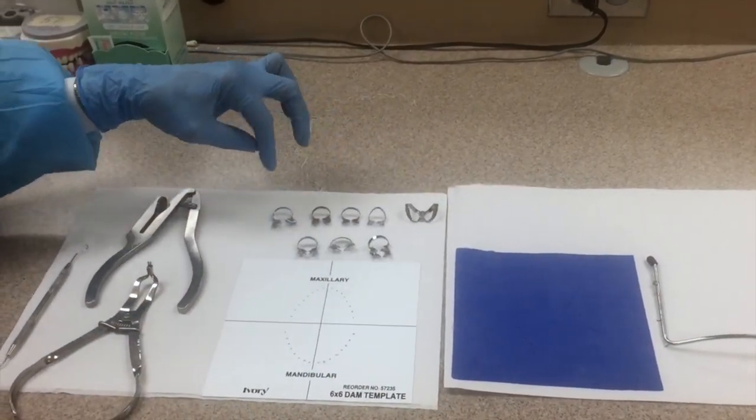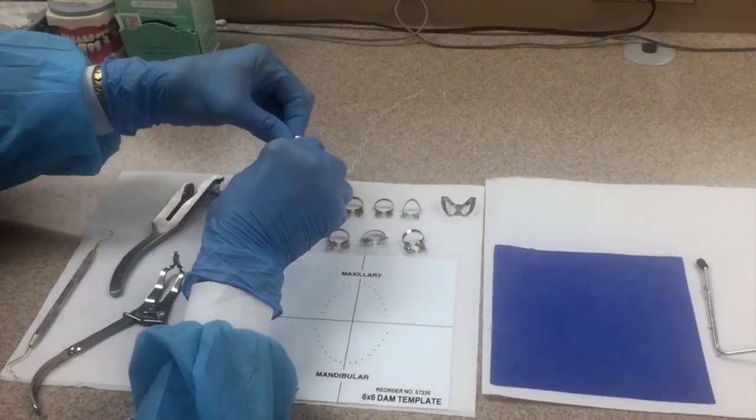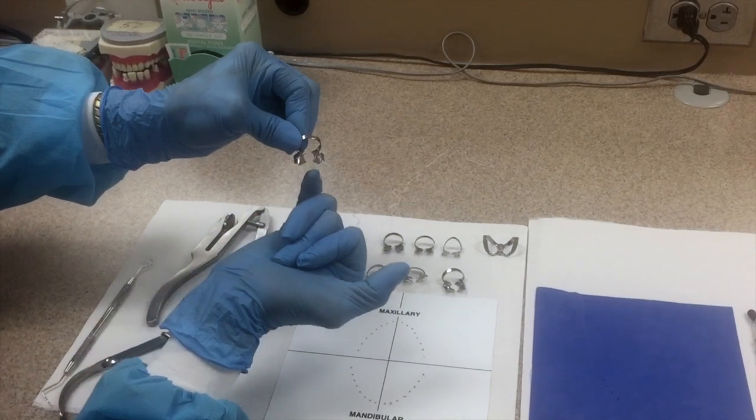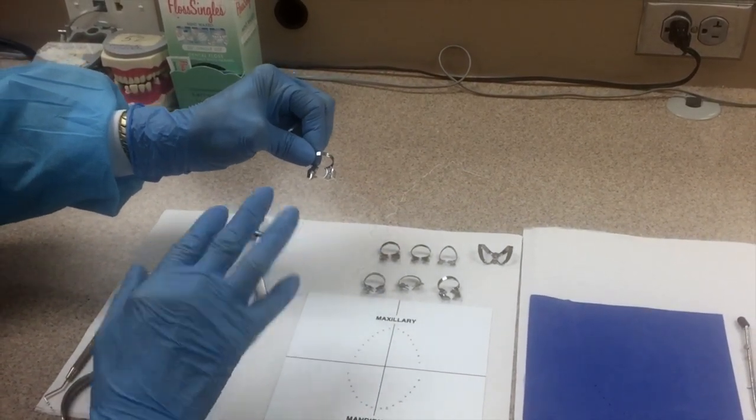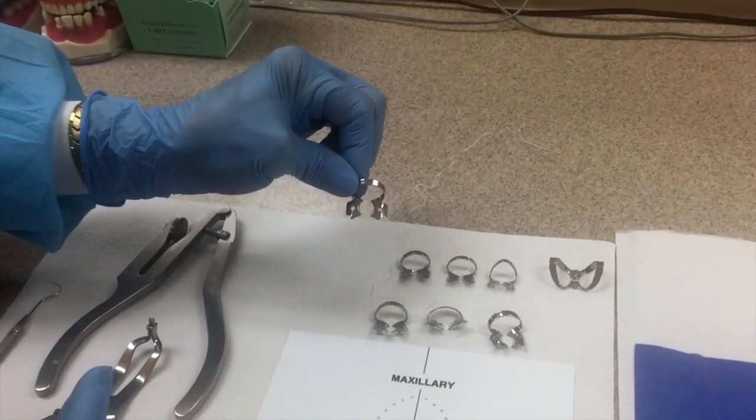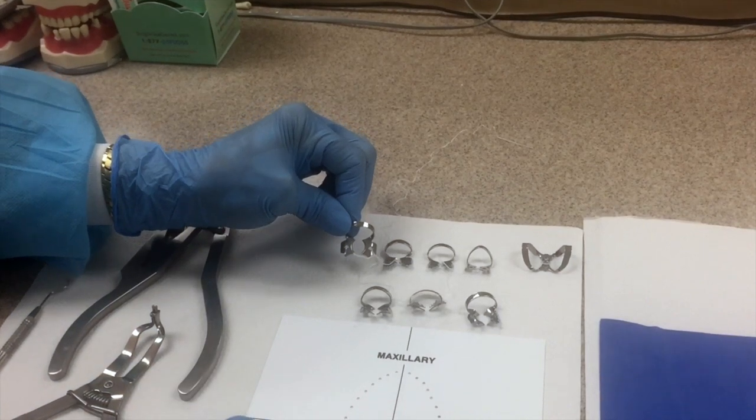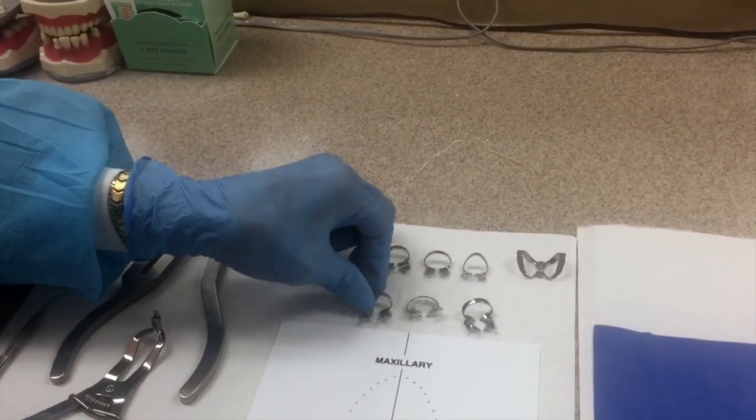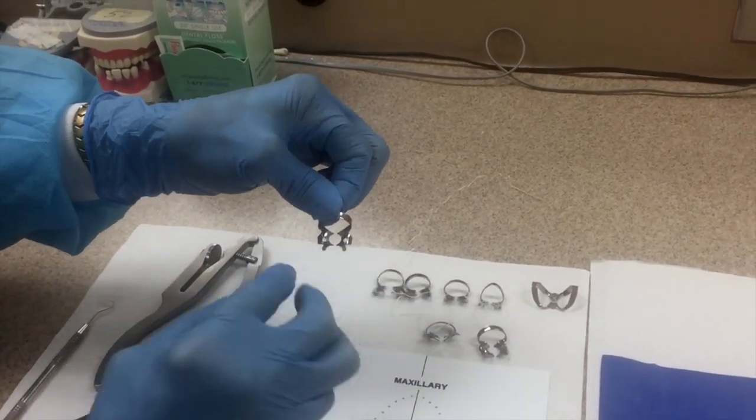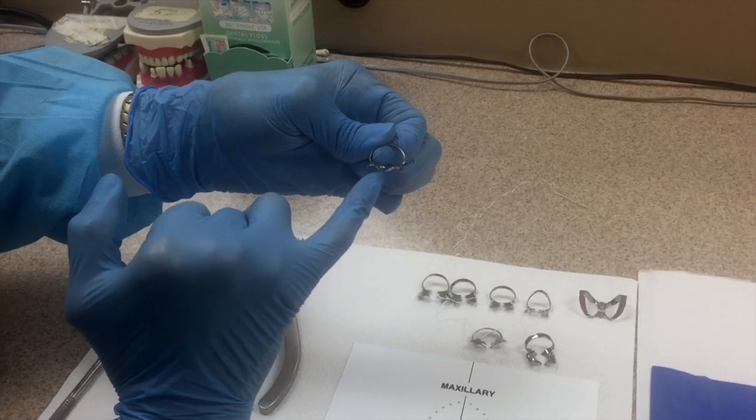These are the retainers or the clamps. On the first row I've got retainers without apically positioned prongs. Each prong, there's one, two, three, four - each prong must be stable on a tooth. If the tooth has a very flat contour or if the gingiva is really covering your prep and we need to pull the gingiva down so we can have good access, we can use an apically positioned prong.